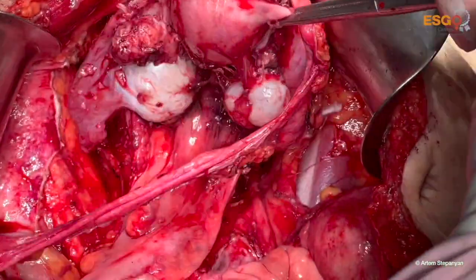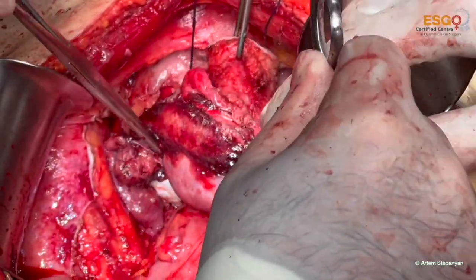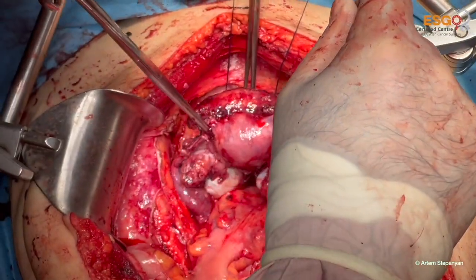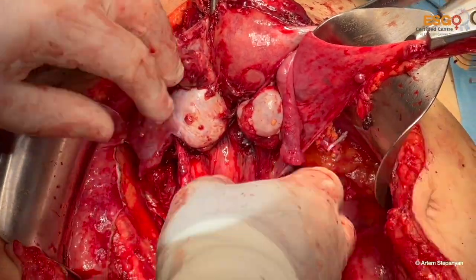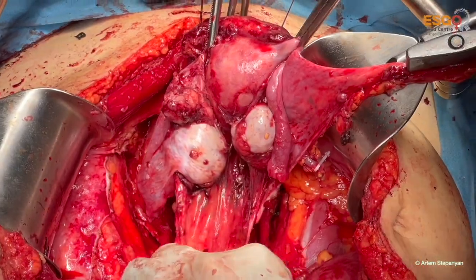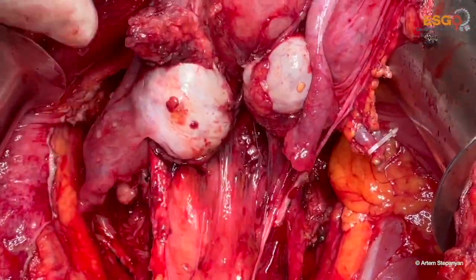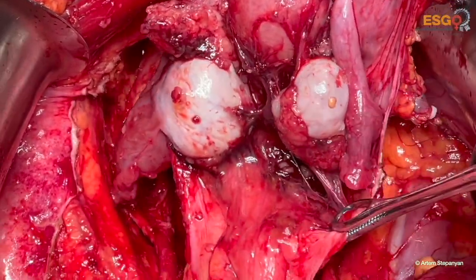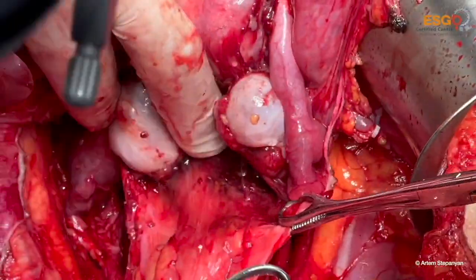And here we can decide the situation with the rectum. It is obvious here that you see the specimen, you know, totally detached and attached to the rectum only. And here we see the Douglas's pouch and the infiltration of the bowel.